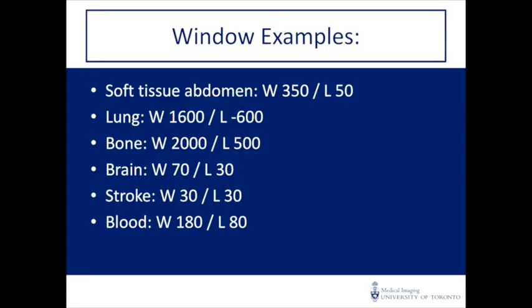Here are some examples of various preset windows with the width and level displayed. Again, don't kill yourself with the details. This is for reference. Don't try to memorize these. Just understand the basic principle of windowing for now. Later, it's going to be good to keep some ballpark numbers in mind, but that will come with time.